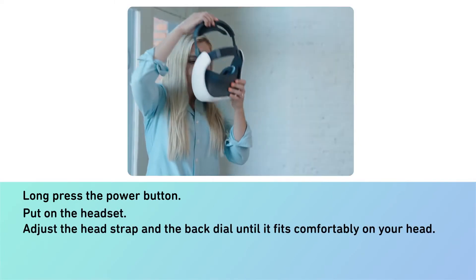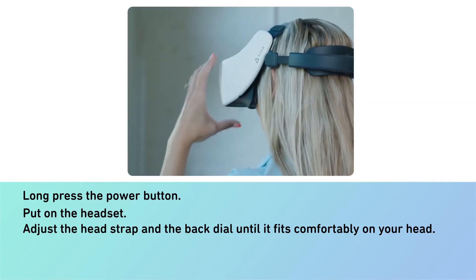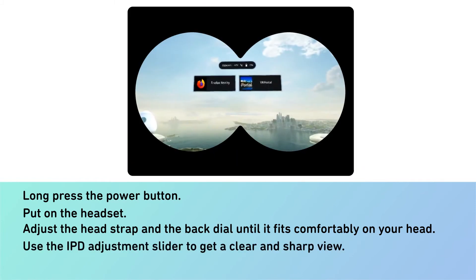Put on the headset. Adjust the head strap and the back dial until it fits comfortably on your head. Use the IPD adjustment slider to get a clear and sharp view.